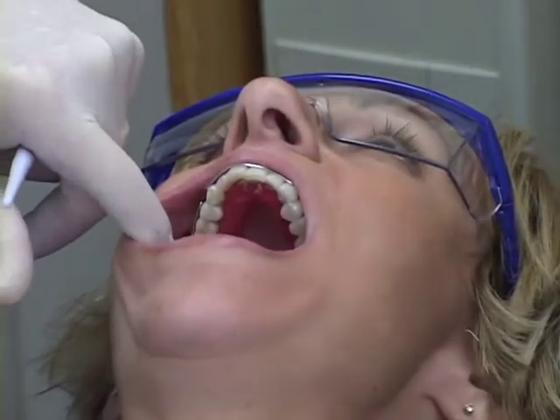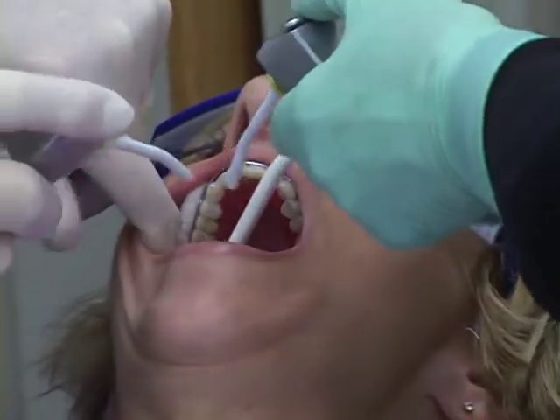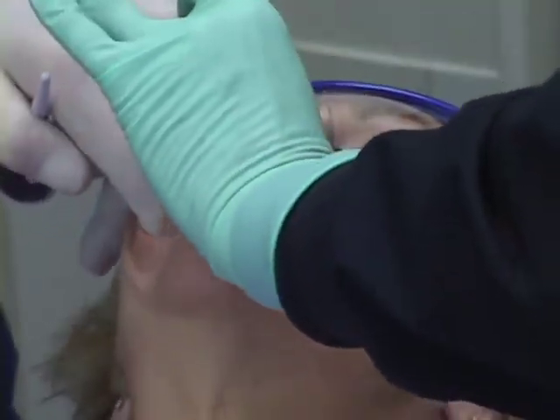Again, in the early phases, there's not really a whole lot of feedback or conversation with the patient. As we get into the finer stages, I'll be eliciting a lot more feedback from the patient. Good. Yeah, right. Chop.